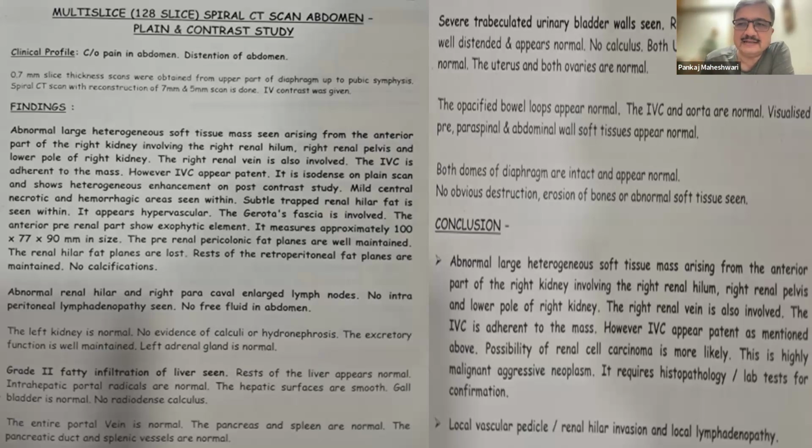So definitely this patient would have needed a repeat proper CT scan of abdomen as well as chest, and then we would plan treatment of the tumor, I mean the right renal mass, and the left upper ureteric stone. DTPA renogram in presence of a one-sided tumor and an obstructed kidney on the other side, I don't think it is going to add anything much in your evaluation.